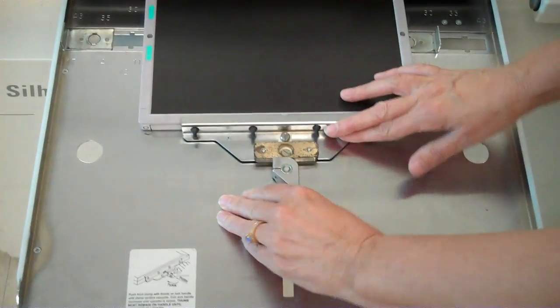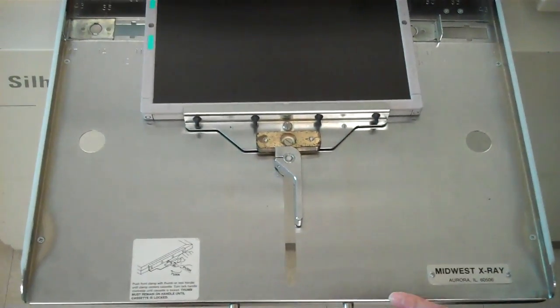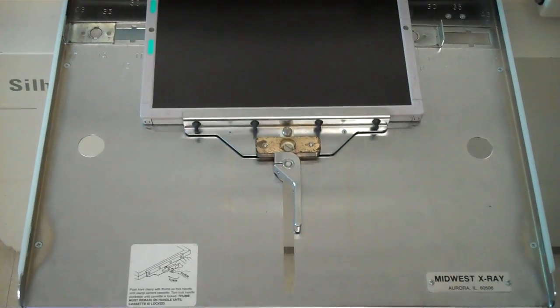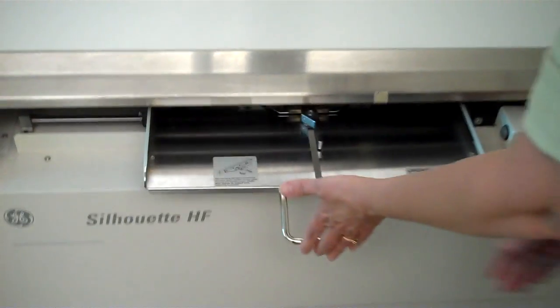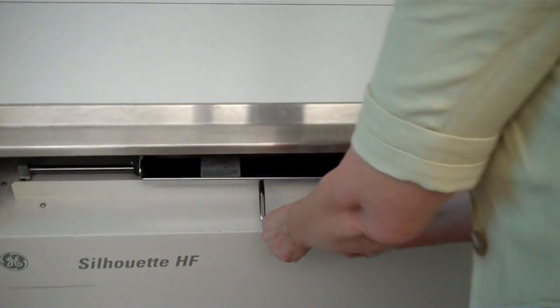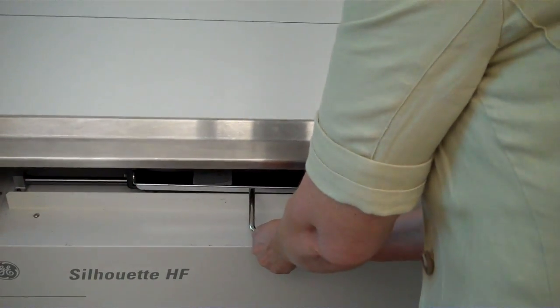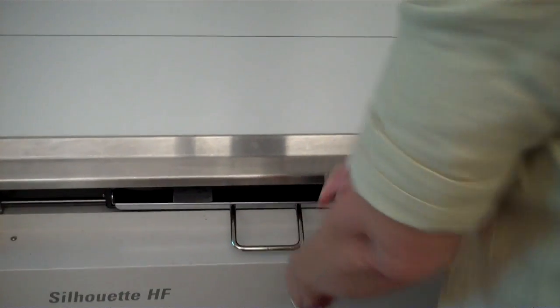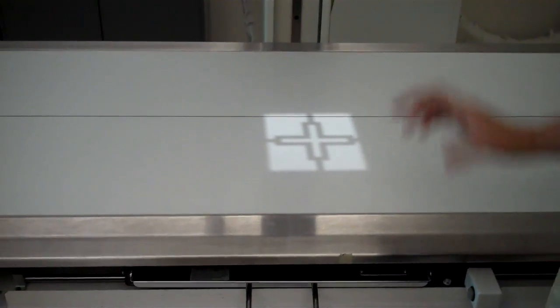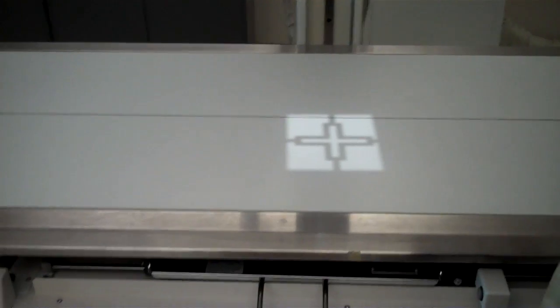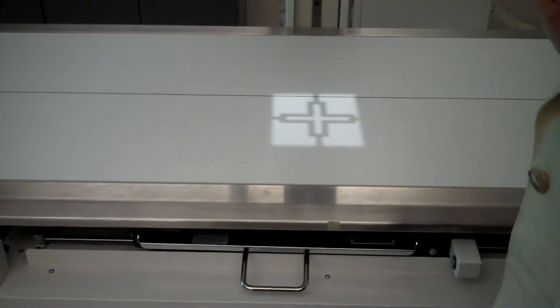Lock the image receptor in place. When the bucky tray is pushed in all the way, transversely, the image receptor and the bucky are in alignment.